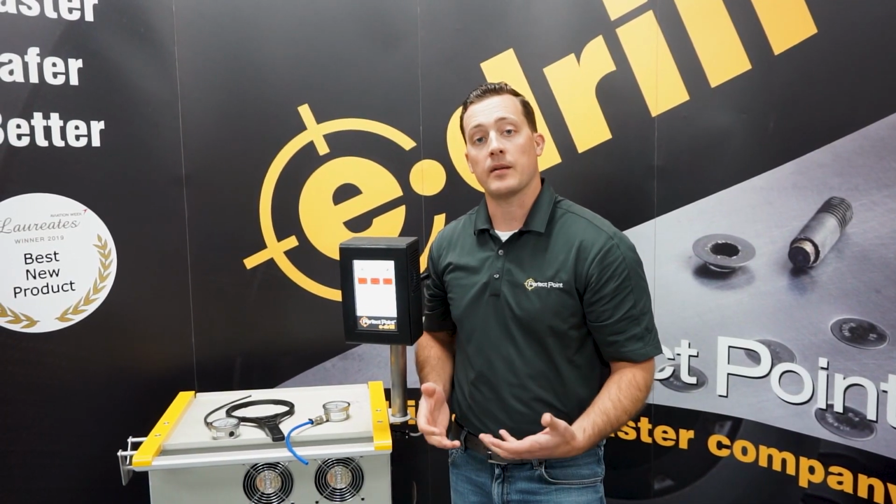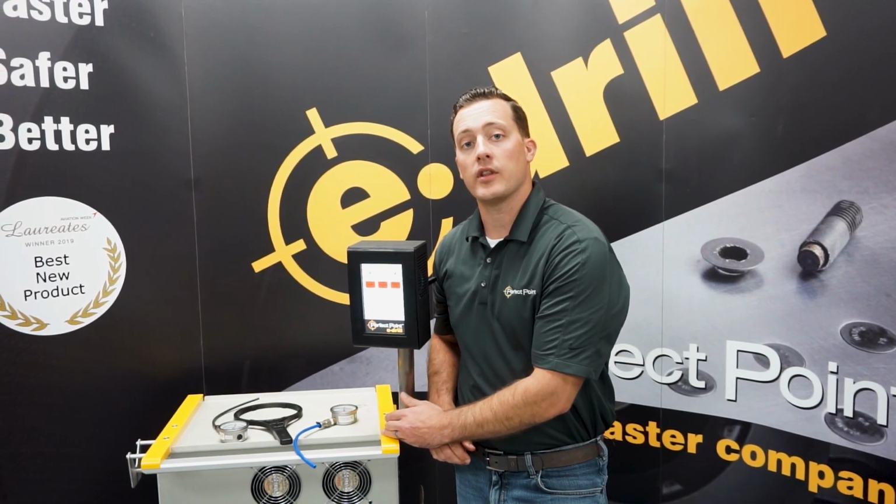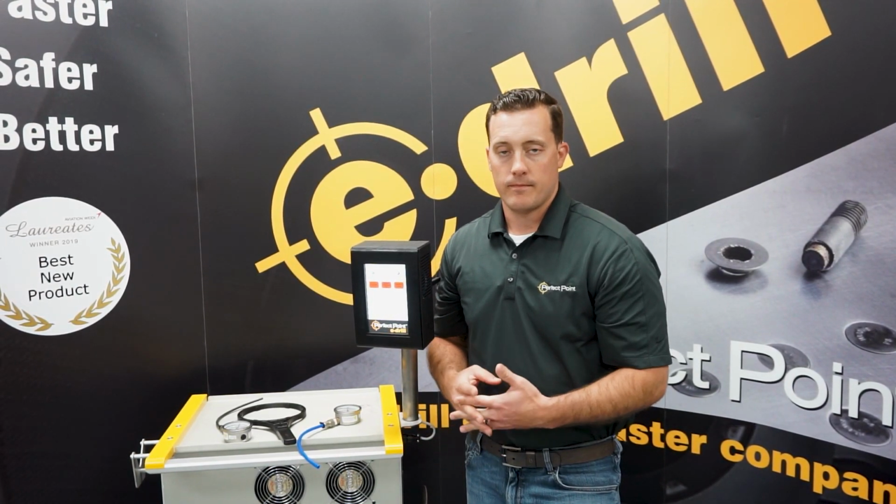And that is how you empty a sediment tank on your e-drill. Again, every 1,500 cuts, the system will stop you and prompt you to do that maintenance. Very simple to do, and continue on.